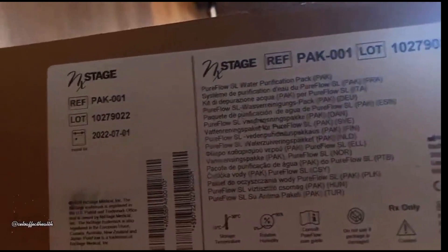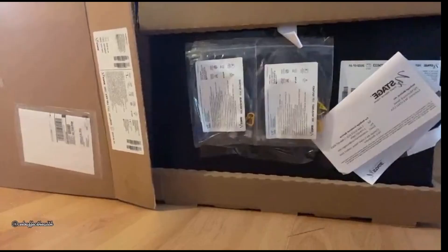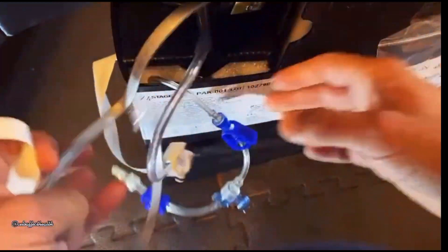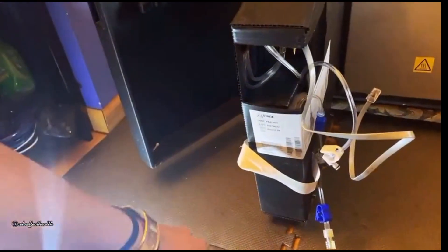Now unbox the new pack you received. It comes with your testing tubes, your drain lines, and the exact same tubing as the previous pack. The orange line with the blue tip is what we will be using.